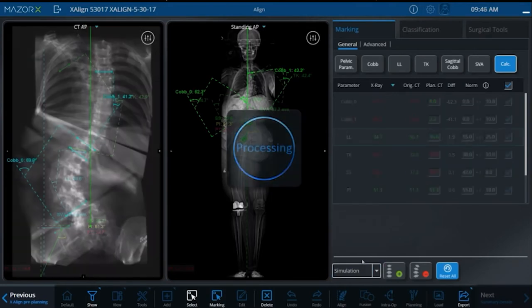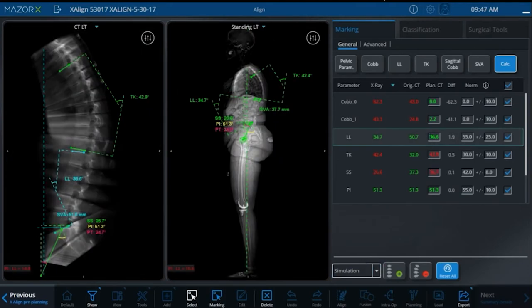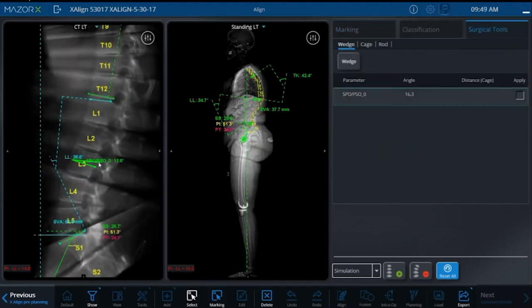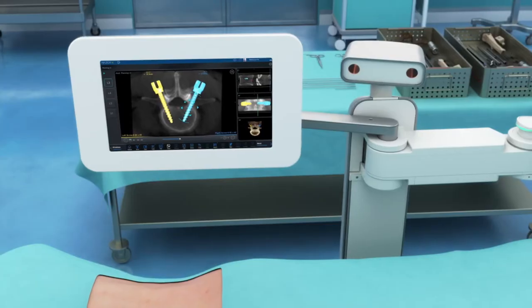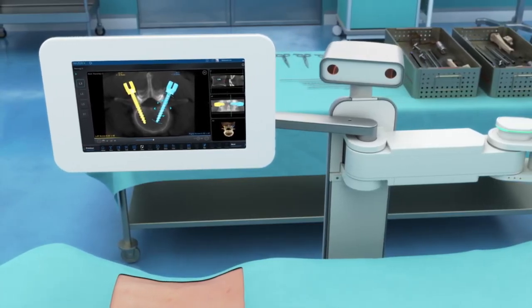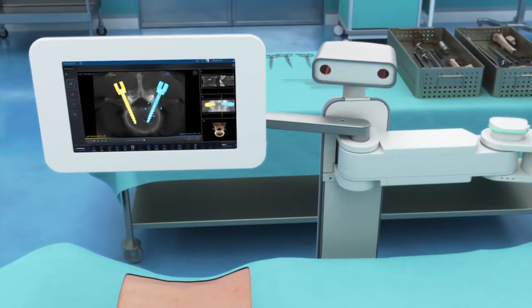An innovative virtually weight-bearing CT scan feeds the 3D alignment plan, providing simulation and visualization of the impact of a correction on the entire spine, increasing outcome predictability. The resulting plan is ready for the surgeon in the operating room.